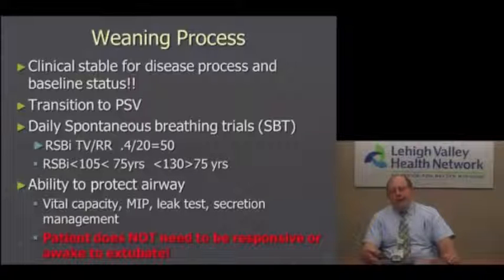We do a leak test. This is a test to see, is there evidence of airway edema or possibly other problems around the vocal cord. As you well know, the endotracheal tube at the bottom has a cuff, okay? If that cuff is inflated, the air goes through the endotracheal tube into the lungs. If the cuff is deflated, the air will escape around the oropharynx and go out into the atmosphere. So what we do is we have the patient, let's say on a tidal volume of 500, and they're getting 500 back on the spirometer, so the patient has no leak, which we expect, all right?